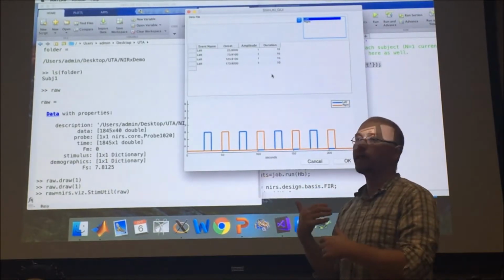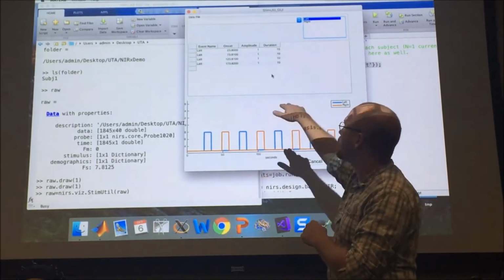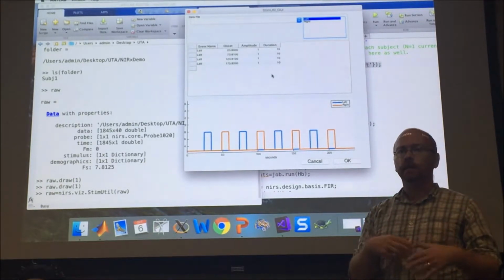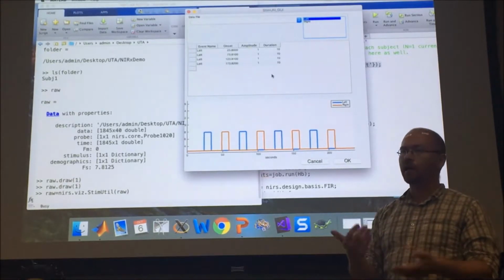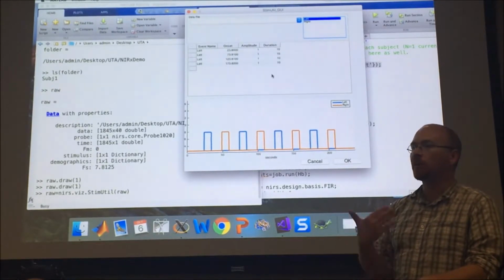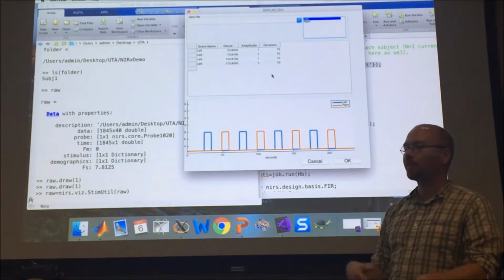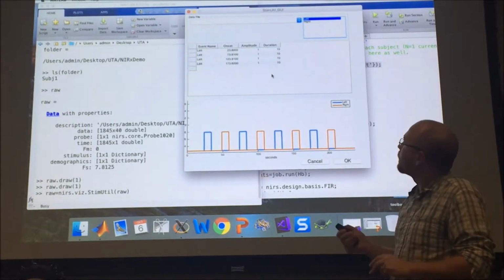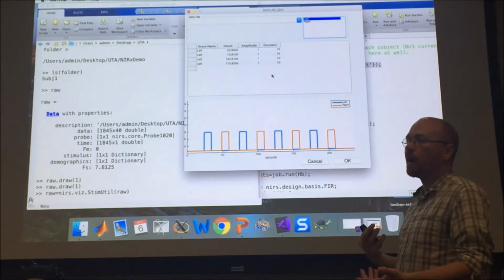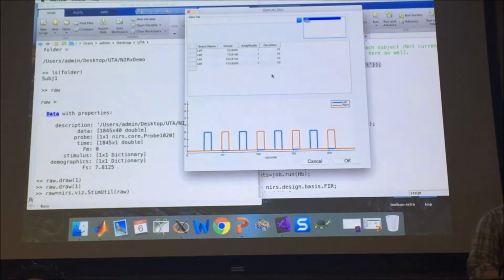And so you can enter in this, and actually there are ways to do both linear and nonlinear interactions with the toolbox using that kind of amplitude information. And that's something that in the fMRI community, people are actually reasonably familiar with. SPM, AFNI, FSL all offer that as options. And so a lot of my colleagues from the fMRI fields were coming to me asking, why can't I do this with NIRS? And so we had to code it up so that they could. But if you're wondering what amplitude is, it gives you a whole range of being able to design much more complicated types of experiments where we can look at other factors.